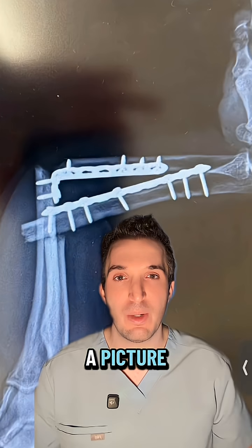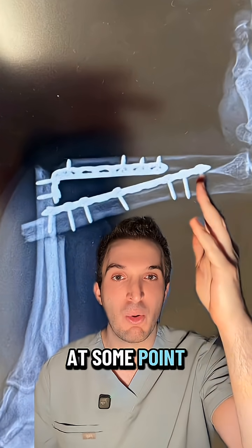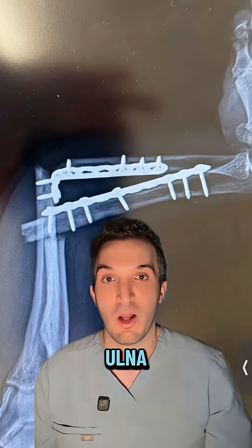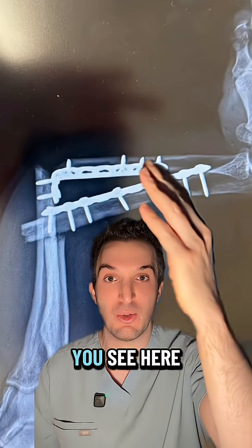I can tell a lot from a picture. For example, this is an unlucky individual. At some point in their life, they fractured both the radius and ulna, requiring open reduction internal fixation. That's the hardware you see here.